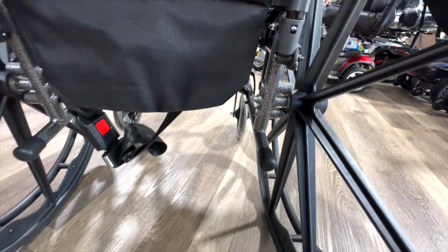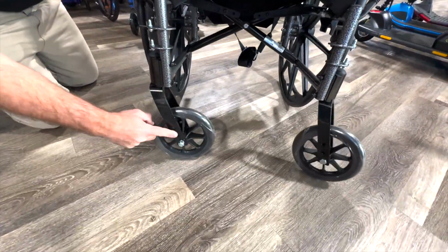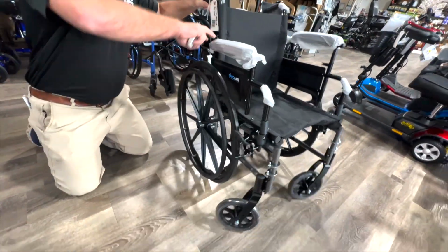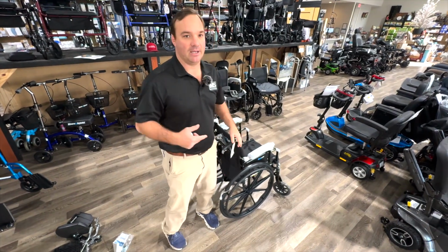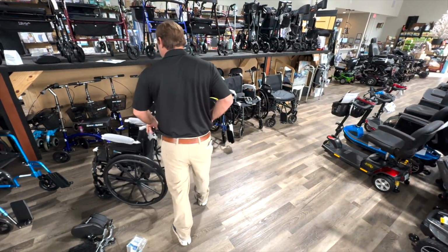But you will have to come in and adjust the caster wheels up here. You have some different holes to level it out. And you can kind of adjust the angle. So that's your K004 16-inch. That comes in an 18 and it comes in a 20. Seat depths are all changeable. So I'm going to put that to the side.